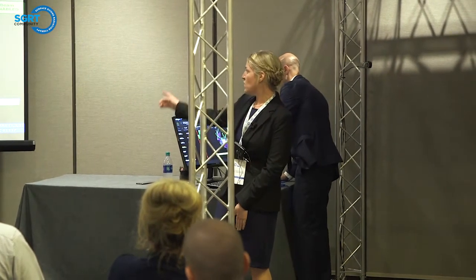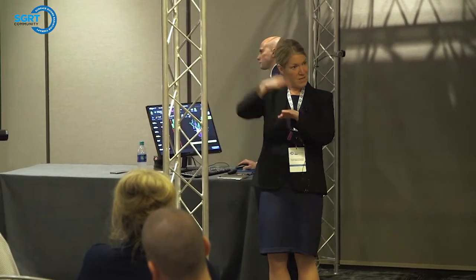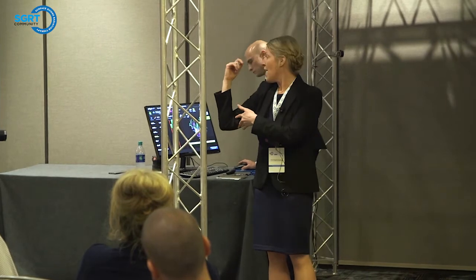All right, so you can see we have the green image. That's where the patient is right now, and it's overlaid on top of the reference of where he should be. If you take a look at the elbow, they're not overlapping. The elbow is actually too far down. So I would know to manipulate this patient arm and bring the arm up, recapture a treatment image, and we're going to keep doing that process until both images align.